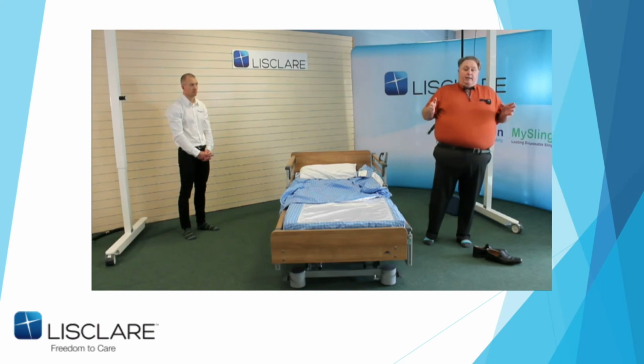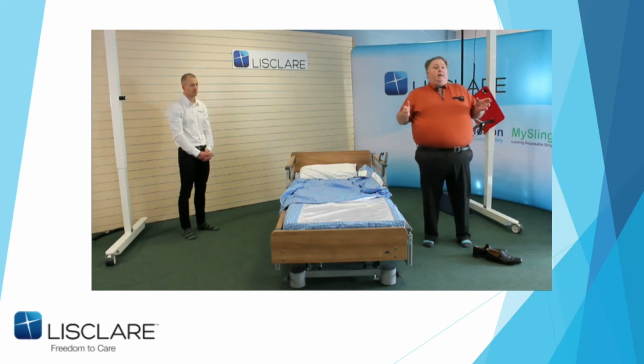First problem about a divan bed is most of them now need step ladders to get on because they're so high. I've seen this quite a lot with clients: they've raised them up to use those standing aids, and now the poor patient can't get in or move into the centre. But we'll go to the next slide and discuss that.